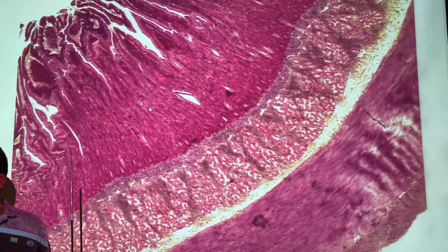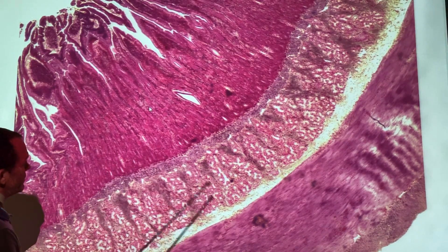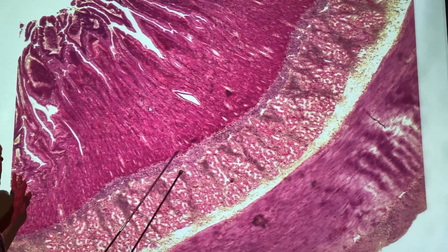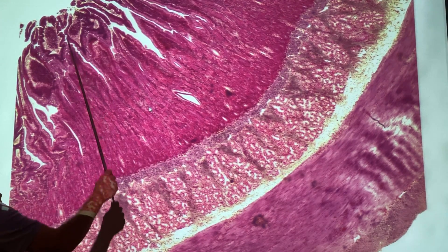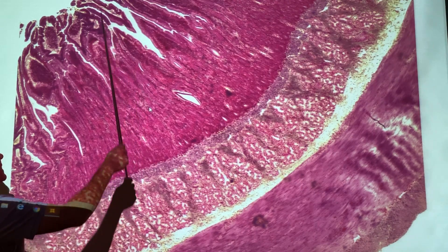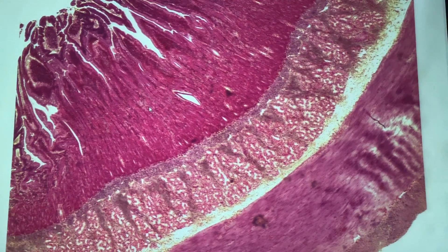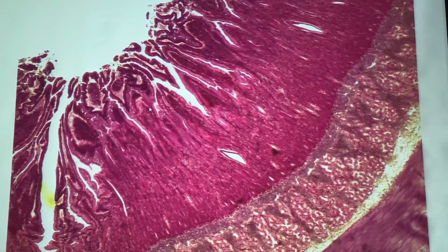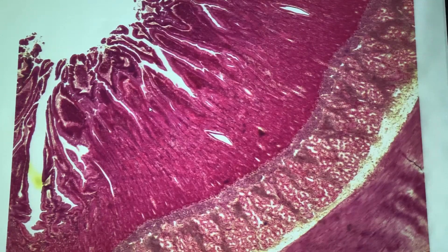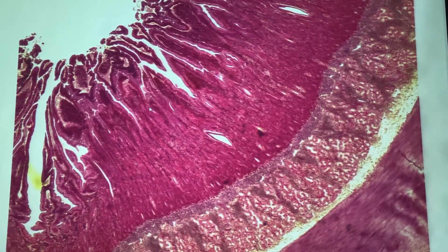This is on low power, so it's as far back as I can get on this one. This is your duodenum. You want to first notice how elaborate these extensions are right here. All of your small intestine has villi. Those are the villi of the mucosa, of the inner layer of the duodenum — the duodenum being the first segment of your small intestine.